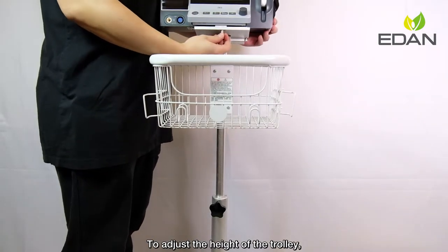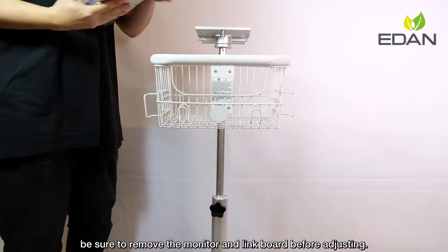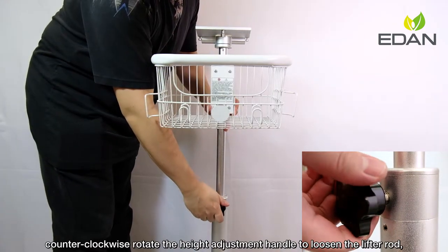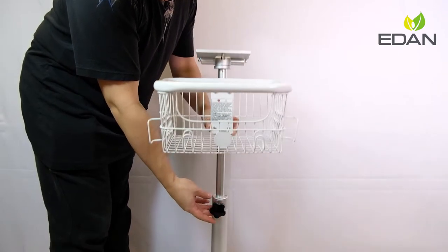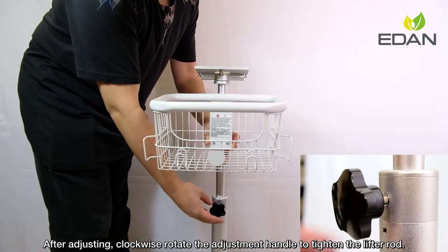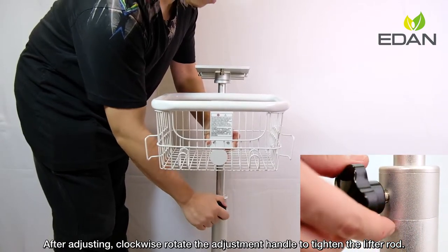To adjust the height of the trolley, be sure to remove the monitor and link board before adjusting. Hold the lift rod steadily, then counterclockwise rotate the height adjustment handle to loosen the lift rod and adjust the height as desired. After adjusting, clockwise rotate the adjustment handle to tighten the lift rod.